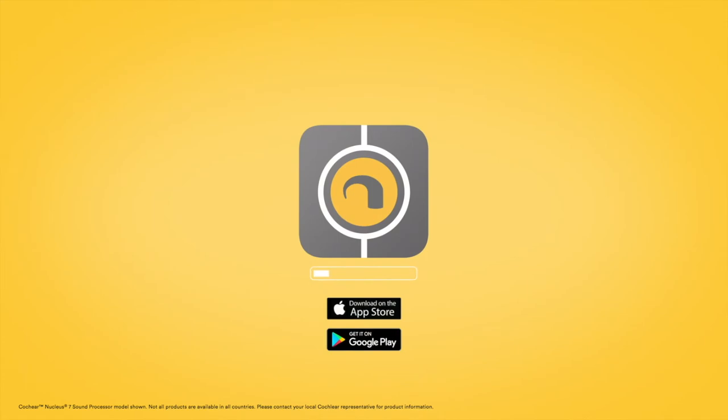To get started, download the app from the Apple App Store or Google Play Store.